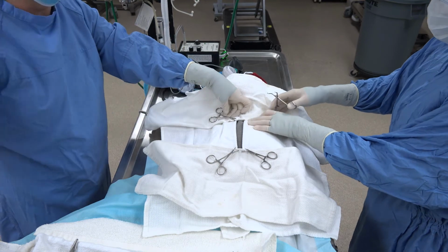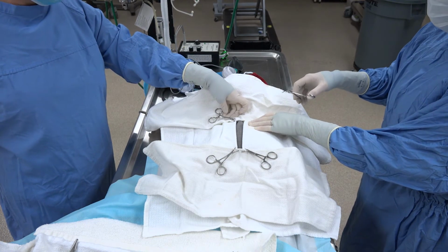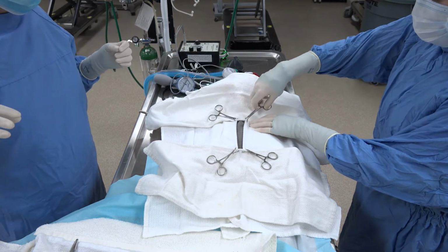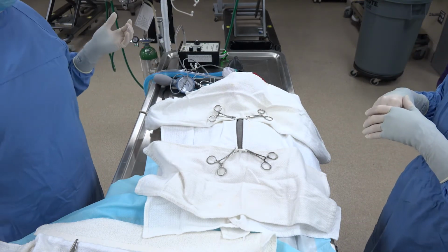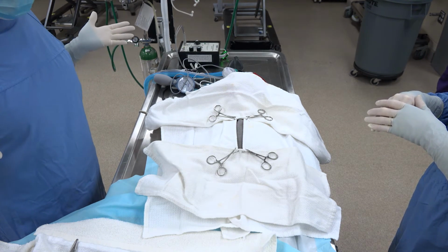If I take the clamp completely out, I now have to put the clamp away somewhere else. I have to throw it off the table. So if you don't catch the skin, it's okay. Just open it up and try again, as long as you don't take it completely out of the drapes and animal area. It's fine. Just try again. All right. Now we've got our 4/4 drapes. We like where it is.